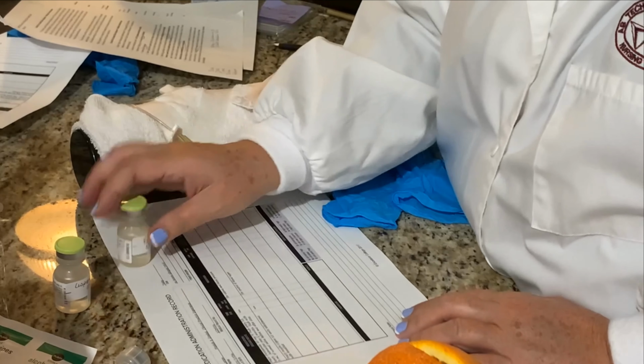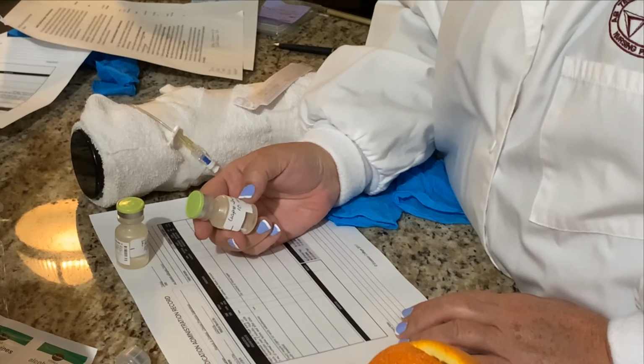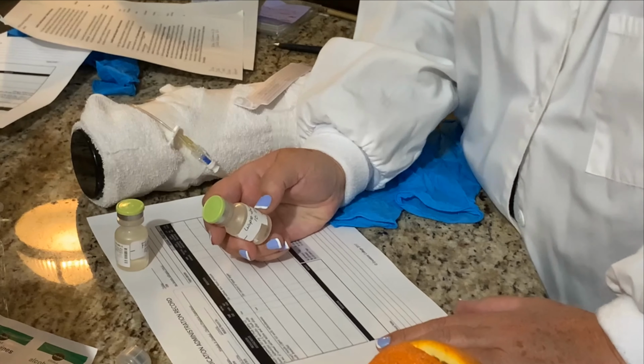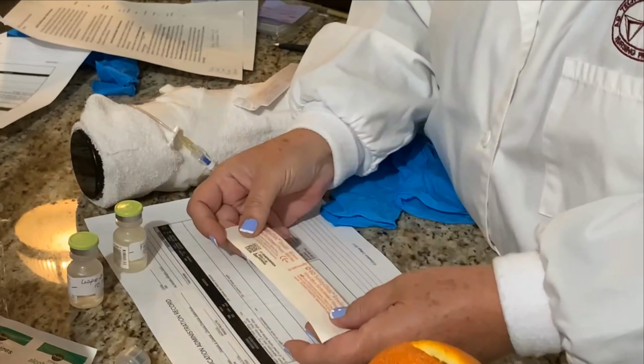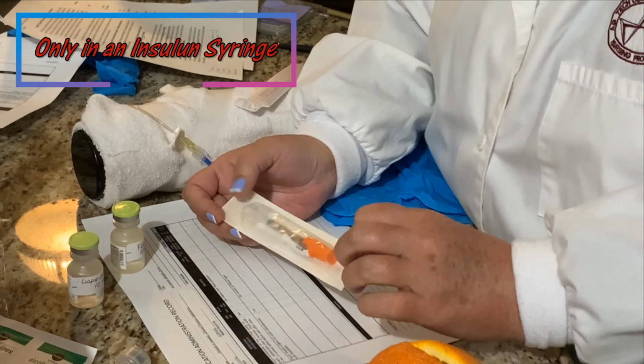That's my first check. The next one, I'm supposed to give Lispro 10 units sub-Q. And I've got Lispro 10 units. There's no calculation with insulin. It's strictly how many units you're going to give. And I also want to say, make sure you have an insulin syringe. Insulin is only to be given in an insulin syringe.